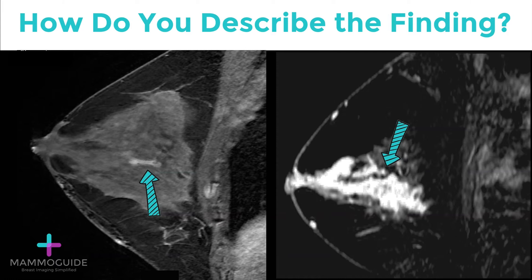How would you describe them? Both of these enhancing lesions are non-mass enhancement. They don't have as distinct borders as a mass.